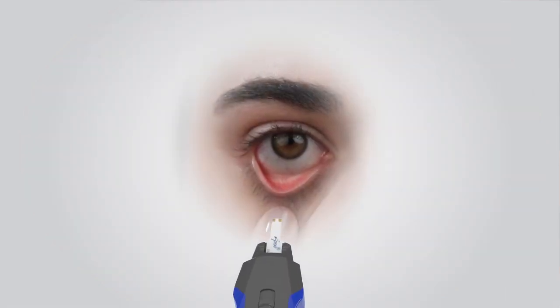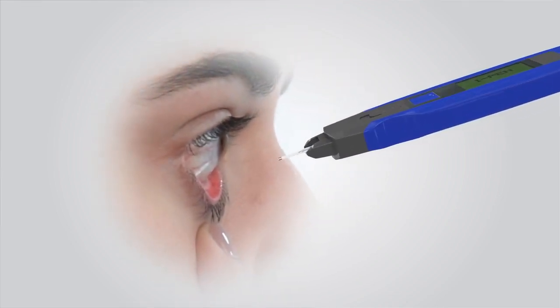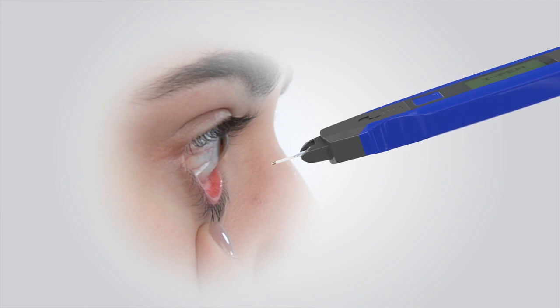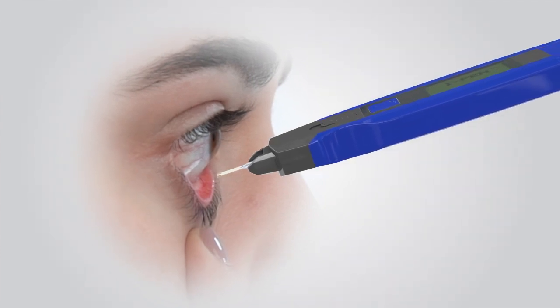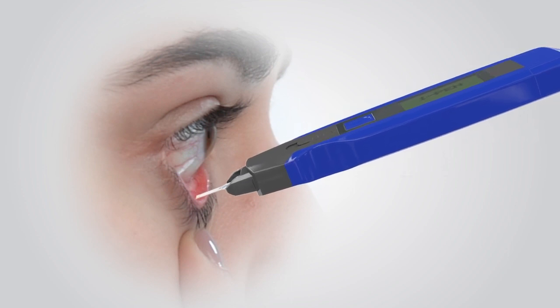Turn on the iPen as indicated by pressing the main power button. With the patient's lower eyelid held, position the tip of the single-use sensor just above the inverted lower eyelid with the LCD screen facing upwards. Approach at a 30-degree horizontal angle and gently lower the end of the single-use sensor onto the conjunctiva on the inside of the lower eyelid.